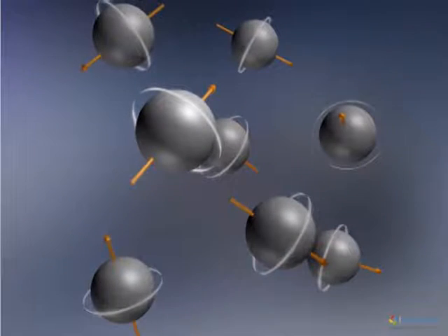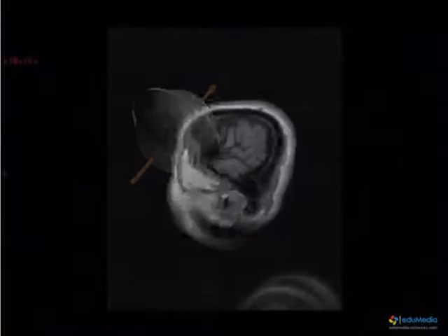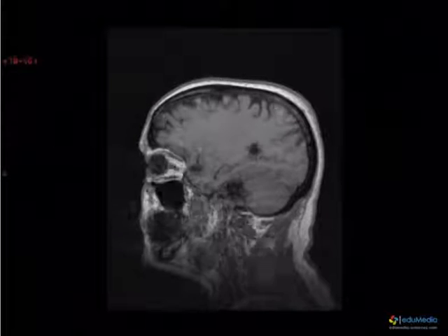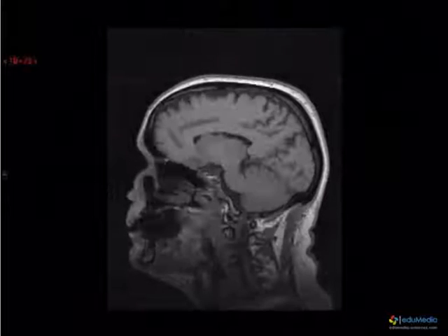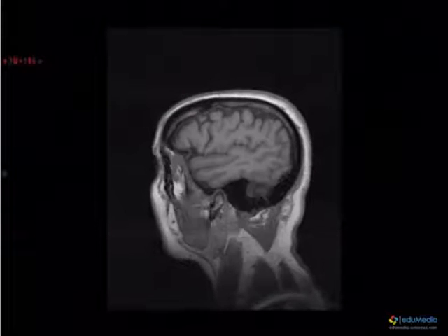It's true that the energy emitted by a single atom is extremely small, but hydrogen is present in every water molecule, and water makes up around 70% of our body mass. We have here a cumulative effect which explains the exceptional quality of the MRI photographs produced.